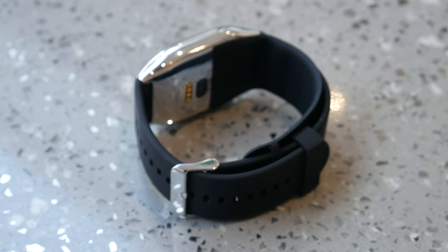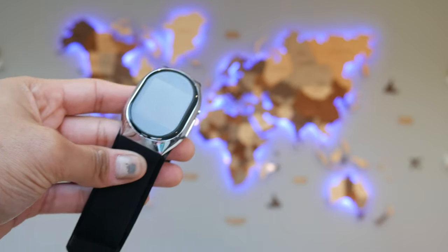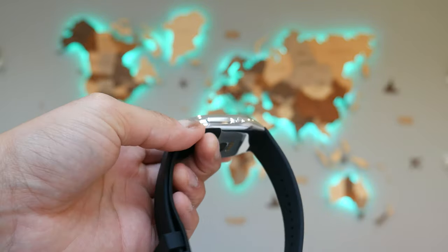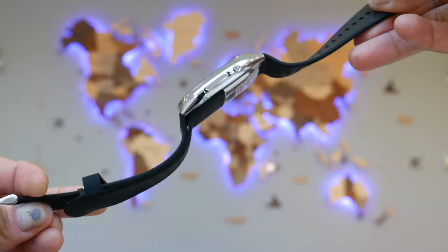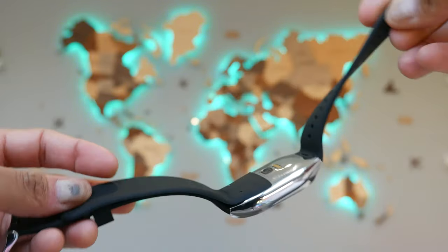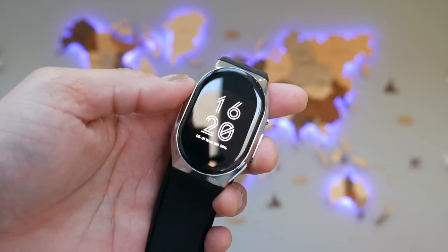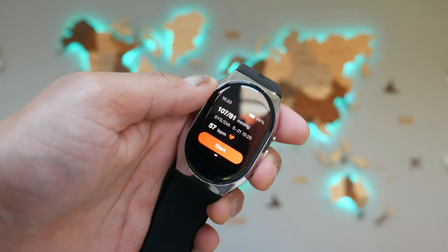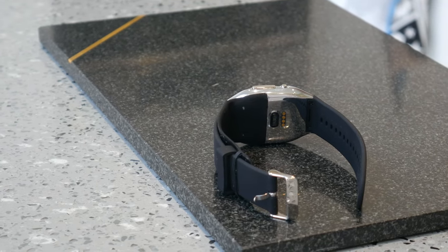Why would you want this smartwatch over others? The main thing it's catered to is health and fitness. It's the only smartwatch with a patented wrist strap that actually inflates to give you a proper blood pressure reading — like the inflatable strap at the doctor's. The watch face pumps air through its own compressor, inflates, and gives you a proper blood pressure reading. That's its key selling point.